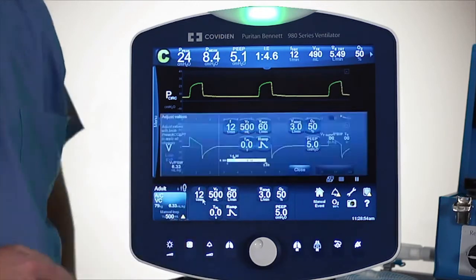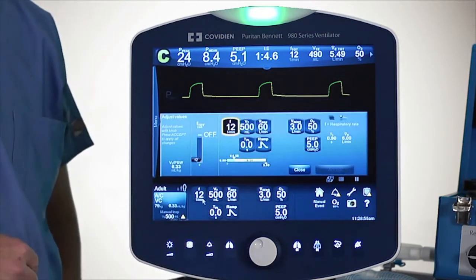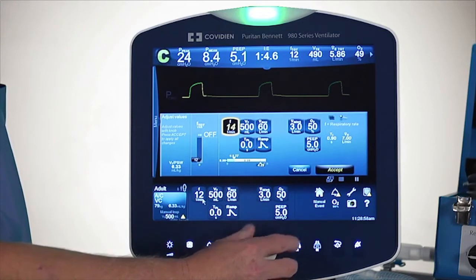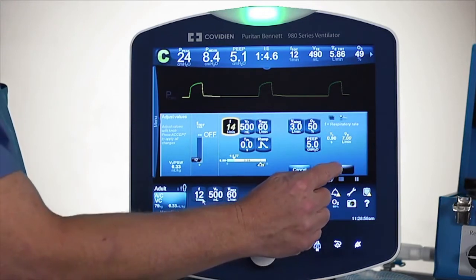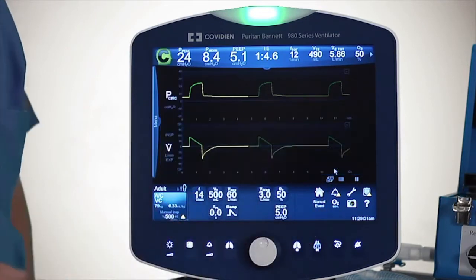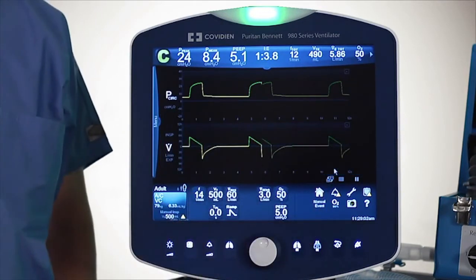I simply touch the rate, I'll turn the knob, and I'll press accept. So just a touch, turn, accept.